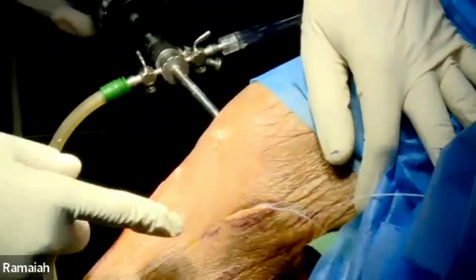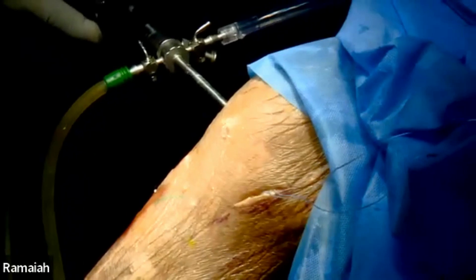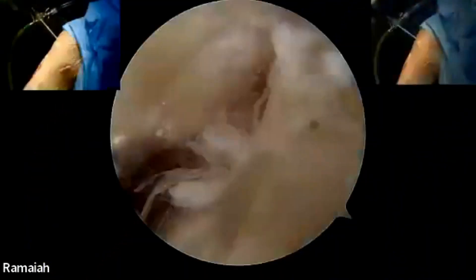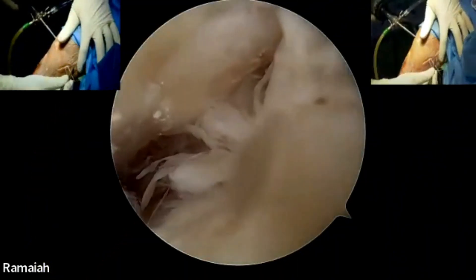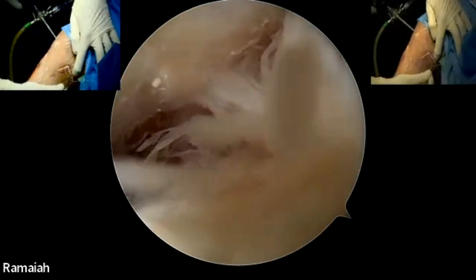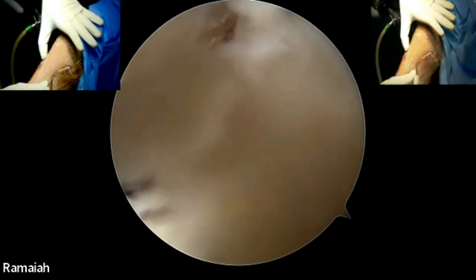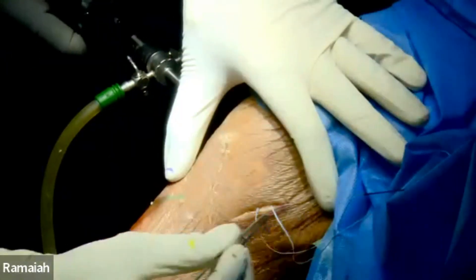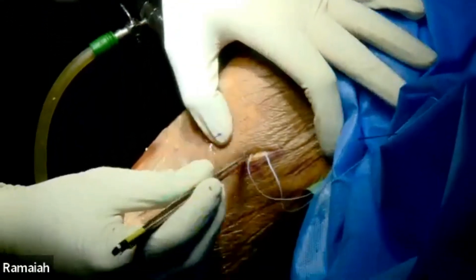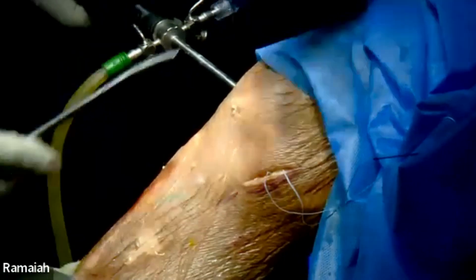I make an incision here. The landmarks for the safety incision: I've made a marking of the adductor tubercle here. Here is the anterior part of the tibia; the posterior part of the tibia is here. Make a line between the adductor tubercle and the posterior part of the tibia — you don't have to go through the whole line, but that is the rough landmark. The joint line is here. Make an incision of about two to three centimeters.